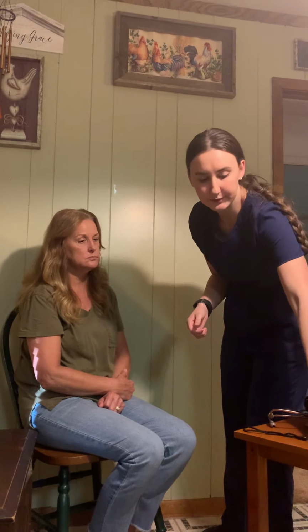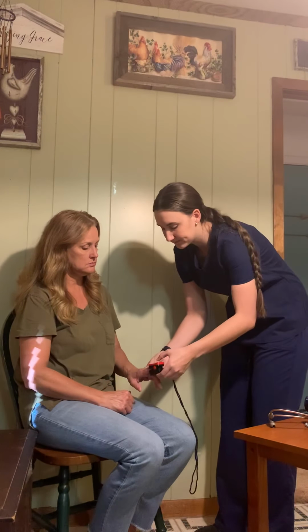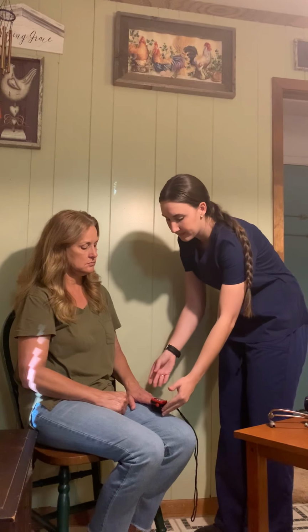Our last vital sign we're going to measure is oxygen saturation. So this measures the amount of oxygen that is in your blood. It uses different wavelength lights and a photodetector to actually measure the amount of oxygen in your blood. So place this on your finger. Wait a second and keep your finger still.